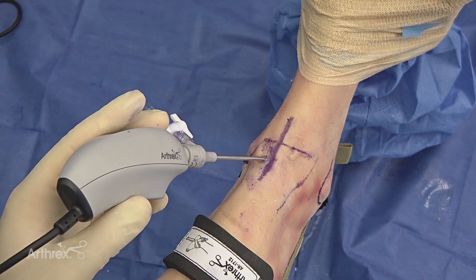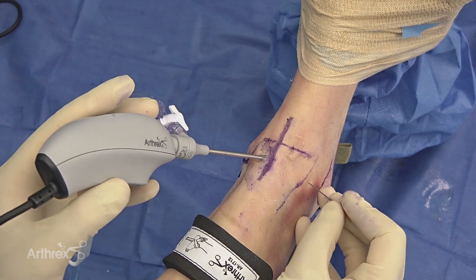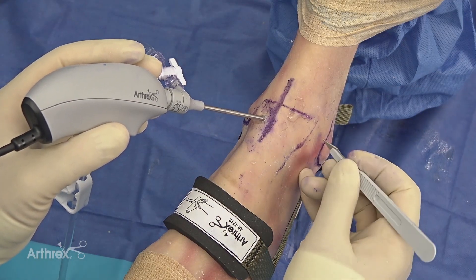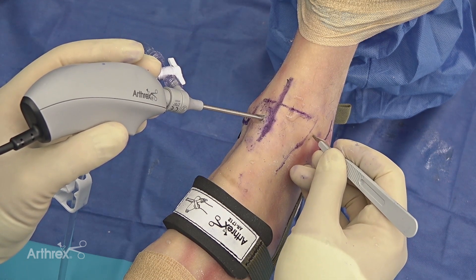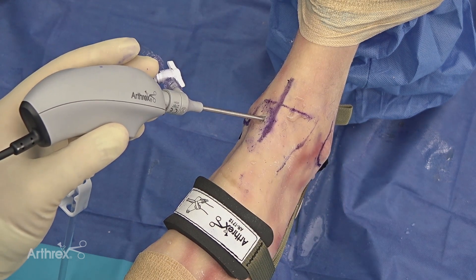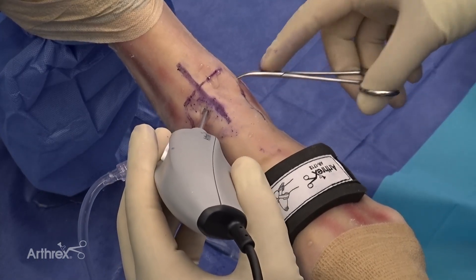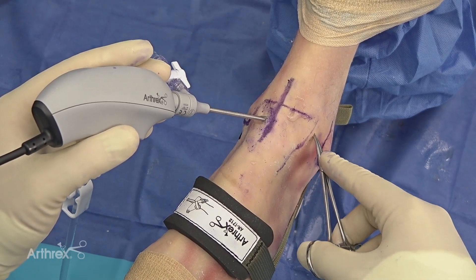At this time we'll create an outflow portal using a second needle, with the idea in mind that we're out of harm's way for the superficial peroneal nerve. As we make our portal, it's important to identify your trajectory and what you'll be accessing. I'll make my incision very superficially and then use the mosquito to do a spread technique — a nick and spread — to sweep the SPN out of the way.